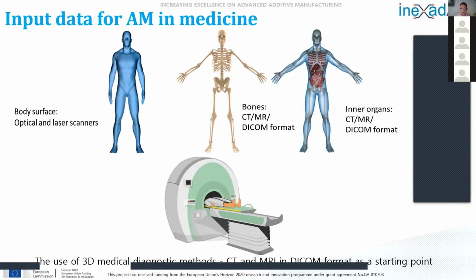First of all, if you need only the outside surface of the body of the patient, then you can use optical and laser scanners. And if you need internal organs or bones from the patient, then you have to apply a different type of technology in order to get the necessary data.